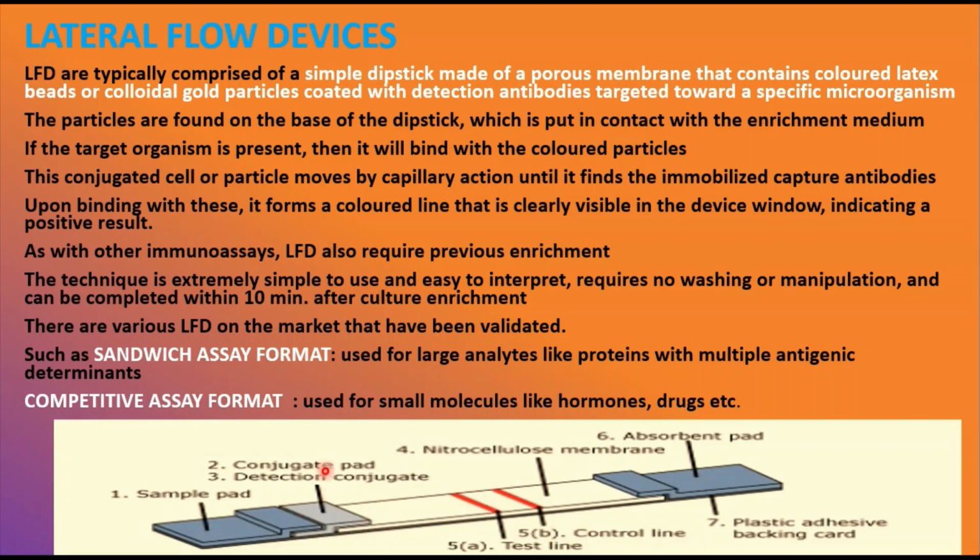Okay, if the target organism is present, then it will bind with the colored particles and it is going to form what we call a colored line that is clearly visible in the device window, indicating a positive result. As with other immunoassays, the LFD also requires some sort of previous enrichment, and the technique is going to be extremely simple to use and easy to interpret.